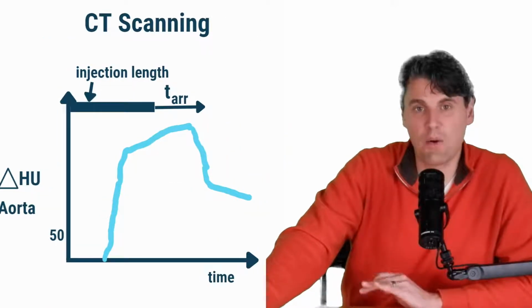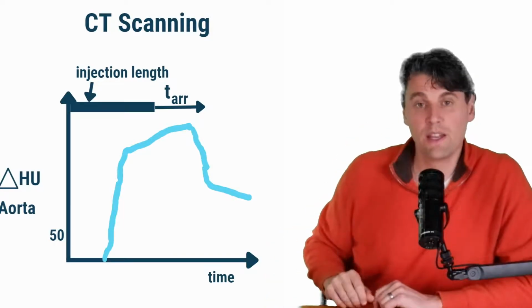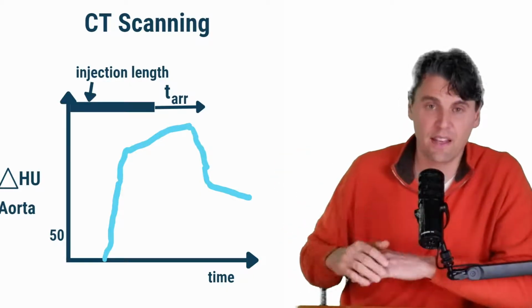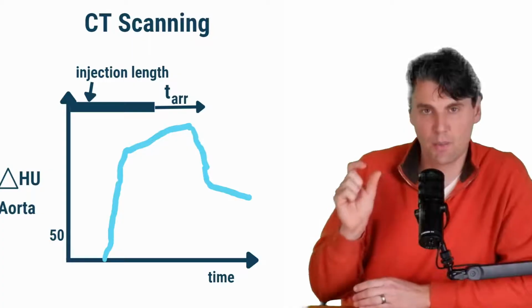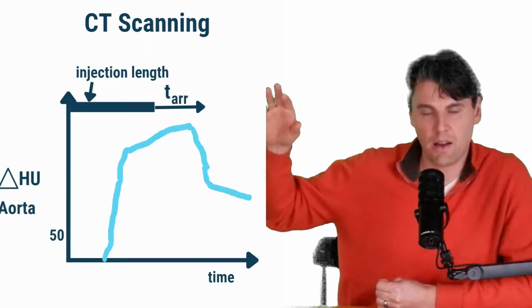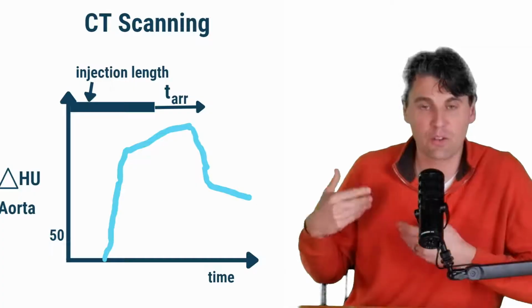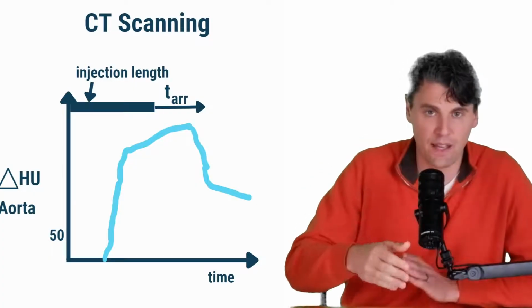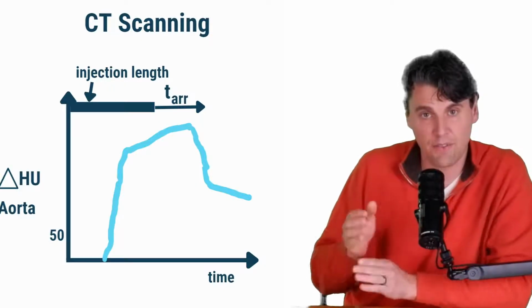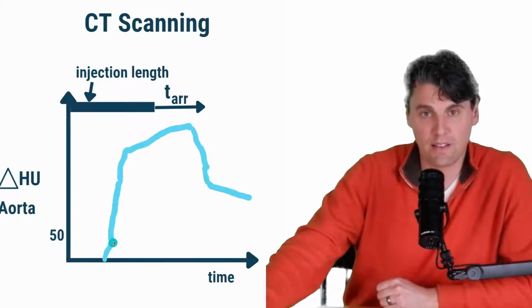We're going to talk about how we can scan this on your CT scanner, and there's a couple of ways you can do it. You can either use a test bolus, where you send contrast in at the same flow rate but a smaller volume right away, and then you make many images and track over time how that contrast comes in. The other option is to track the actual imaging bolus in a monitoring phase, and then prescribe when you want to start your diagnostic phase along with an offset in time. We'll show you how that looks on this plot here.